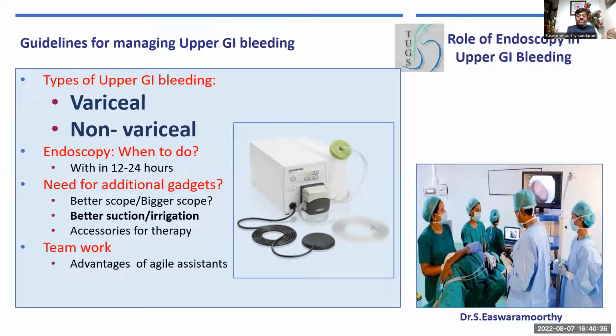That's the other thing I wanted to tell you. Sometimes I'm sure some of your colleagues will be wheeling the whole trolley to the ICU setup, where you need to do the procedure at the bedside of the patient. You have to get all the equipment there and ready. I'm sure Mayo Clinic has a very good unit where hemostasis is done in the ICU setup. So if you have a good setup, get all the equipment as necessary. For example, if the banding fails, do you have the glue? If you have a glue, do you have a spare ampoule? Either you need to go and work as a clinician.